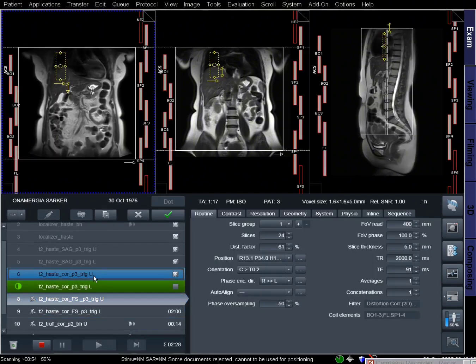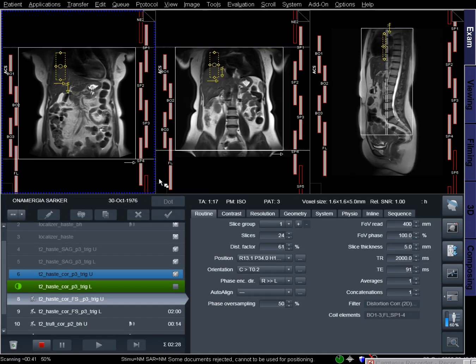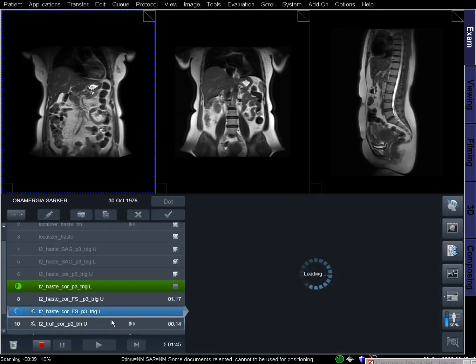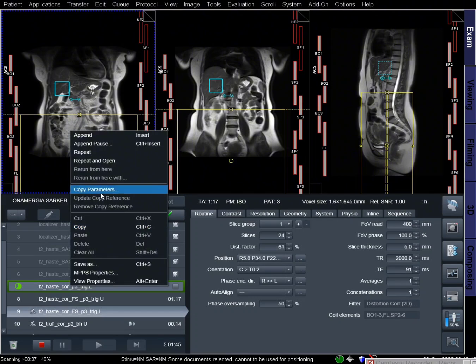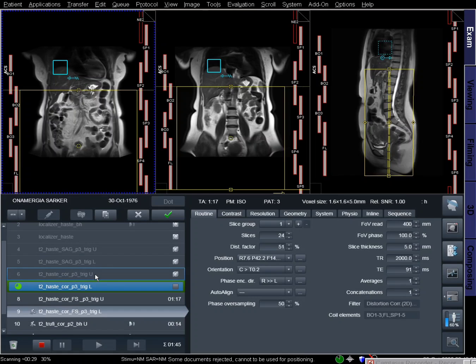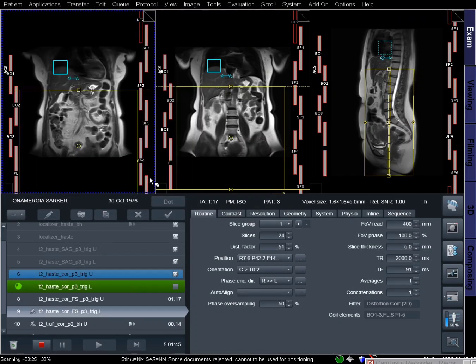To enhance image quality, a gadolinium-based contrast agent may be administered, which helps to differentiate between various organs and tissues more clearly. The entire procedure is non-invasive, painless, and usually takes about 30 to 60 minutes to complete.